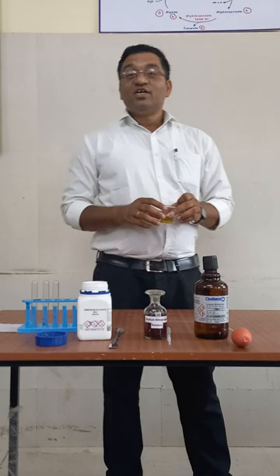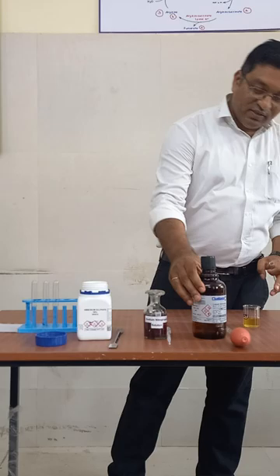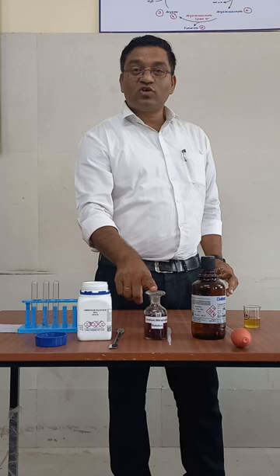In the Rothera's test, you need a urine sample, 3 ml of liquor ammonia, 1 to 2 drops of sodium nitroprusside, and ammonium sulphate powder to saturate the urine.